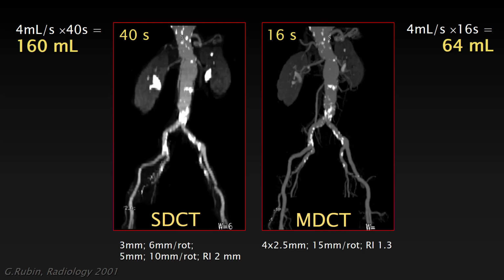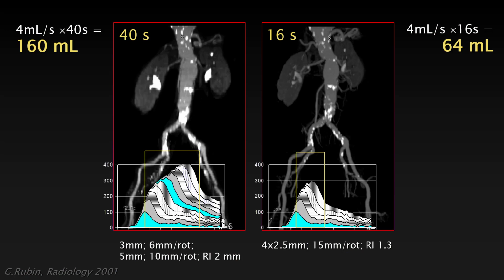But when you compare the degree of enhancement between those 2 scans, it turns out that the newer, better scanner has less arterial enhancement. And then we thought, well, how is that possible? It really puzzled us. But it's easily explained when you think about rule 2, where the enhancement increases cumulatively, because what we in fact did is, instead of injecting a lot of these test boluses and letting the contrast increase over time, we injected much shorter, and so we reasonably cannot expect the enhancement to reach the same level.